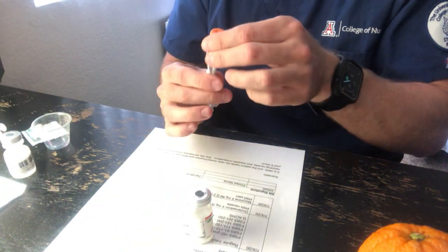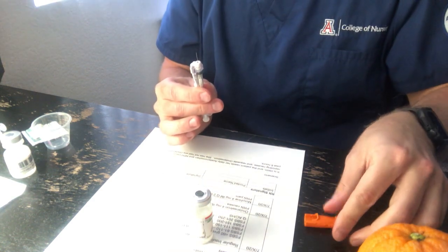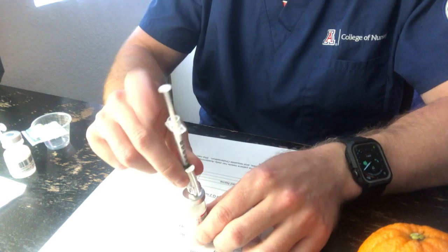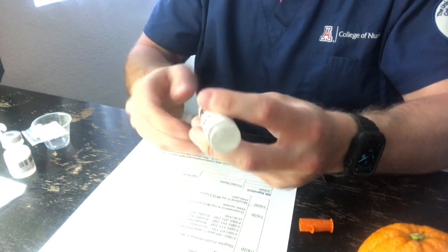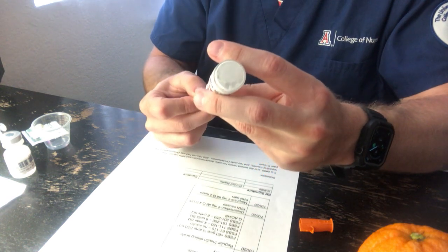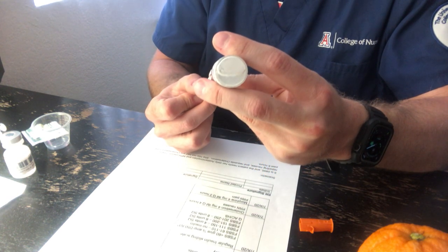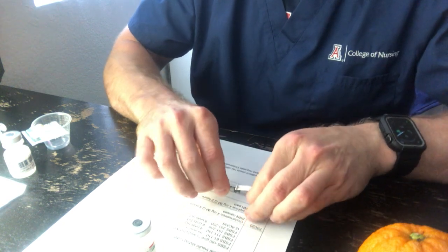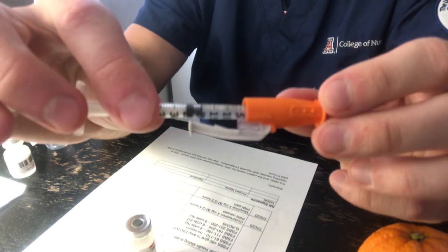I have my insulin syringe. I need to pull 20 units. Going to scoop, grab by the base and seal it. It's 20 units.